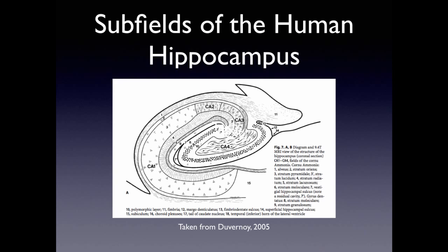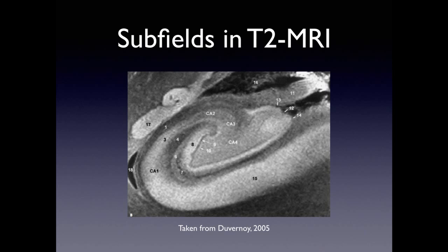It's got this Swiss roll shape with the CA wrapping around the dentate. And then you have this dark section in the middle called the dark band. It's composed of these different stratum structures. I'll just call it the SRLM. And this is how the hippocampus appears in a T2 image. So, again, you have the dentate here in the middle, CA wrapped around it, and the SRLM, this dark structure that separates the two in the middle. This is the image we're going to be using for the example segmentations.